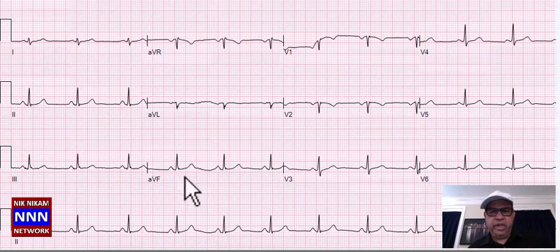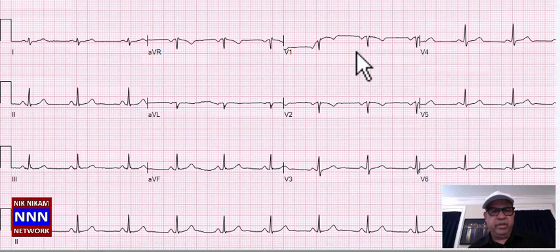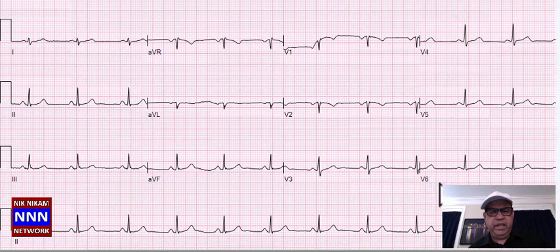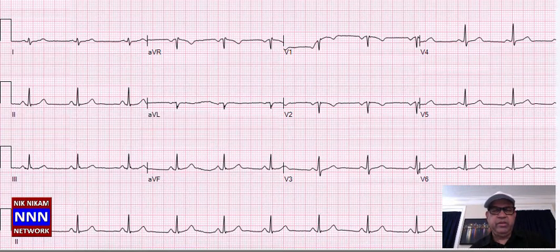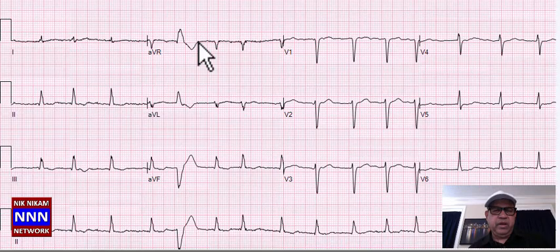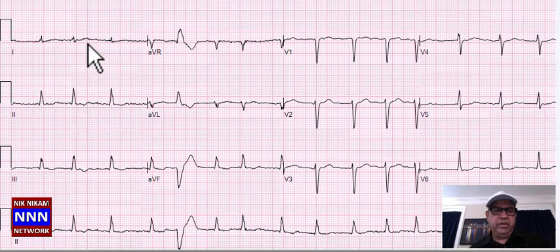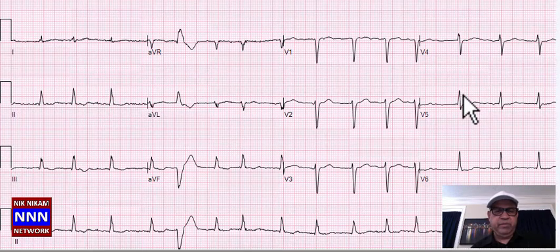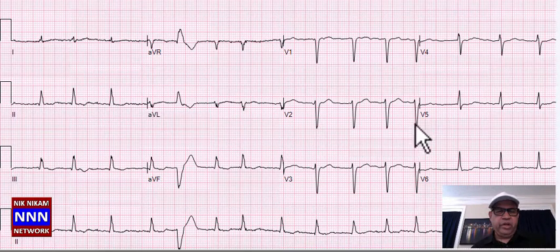We have sinus rhythm, nice, at 68 per minute. This is a 35-year-old female patient — T-wave inversion V1, V2 is a normal finding. Otherwise nothing really spectacular.